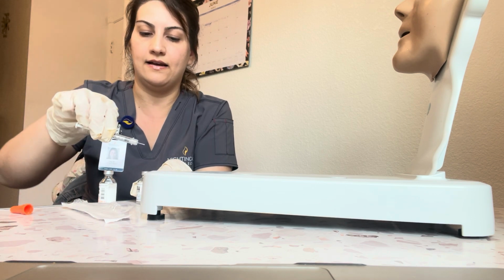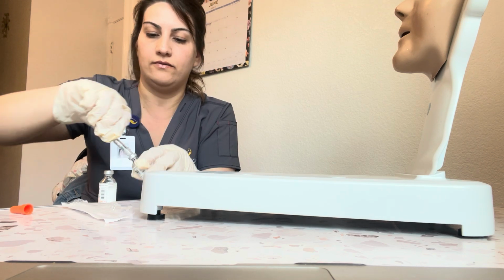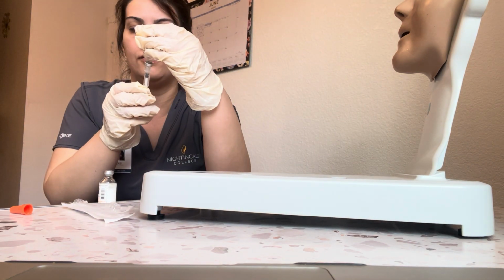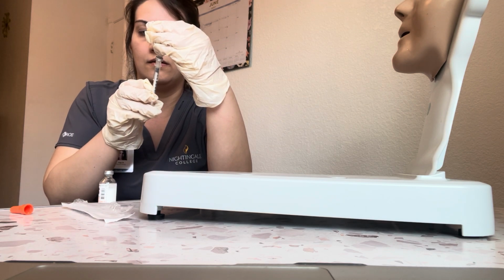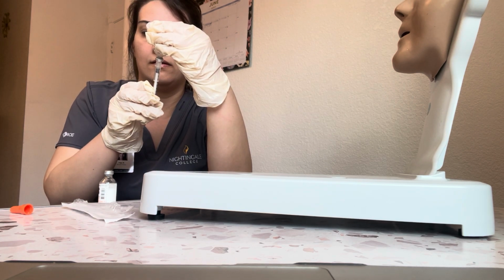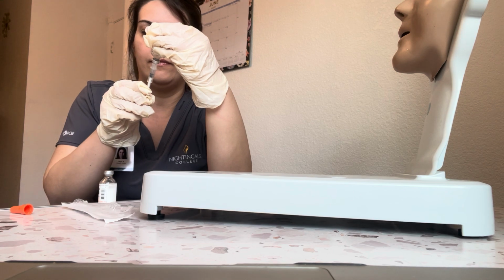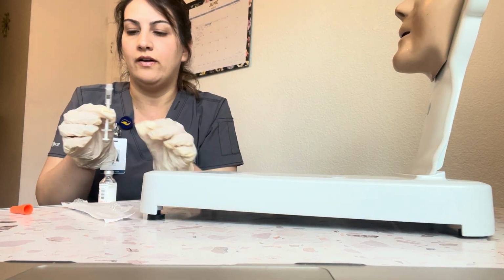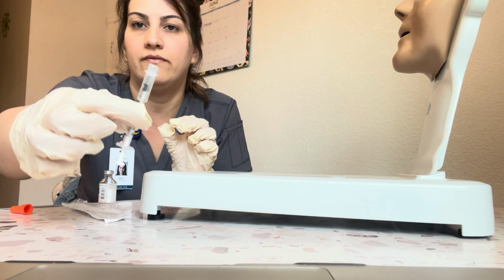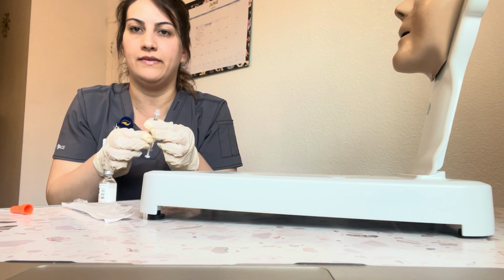So we're going to get the NPH 8 units, which is going to totalize to 12 units. Nurse and I verify against MR 12 units of medication for my patient, which is going to be given subcutaneously.